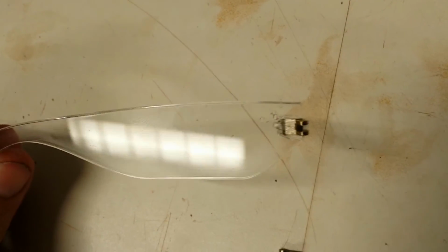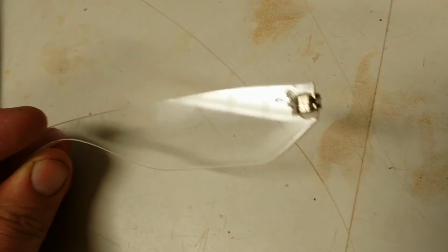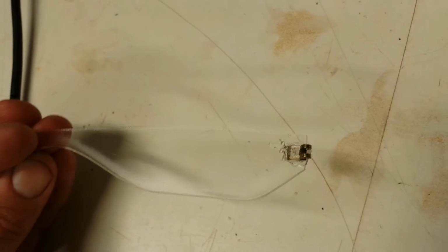That is a laser cut glasses stem. Arm, I don't know what you call these. I kind of think of them as arms, with a hinge set into it. So that's pretty cool. So there you have it. How to take the hinges out of a perfectly good pair of eyeglasses and put them in something else. If you ever wanted to do that for some reason. Yay?